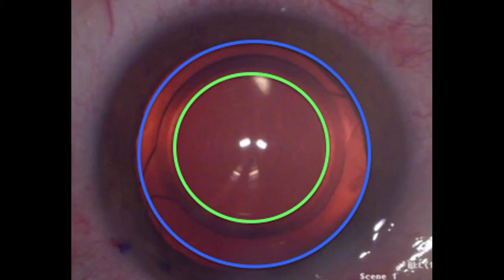The visually centered PPC capsulotomy was outlined as the green circle and was displaced with respect to the center of the pupil as predicted. The precision pulse capsulotomy allows the surgeon to center the capsulotomy on the visual axis for the most stable long-term optical result.